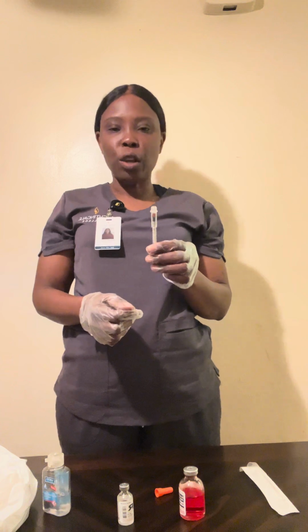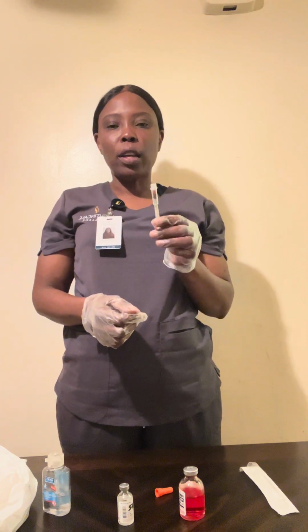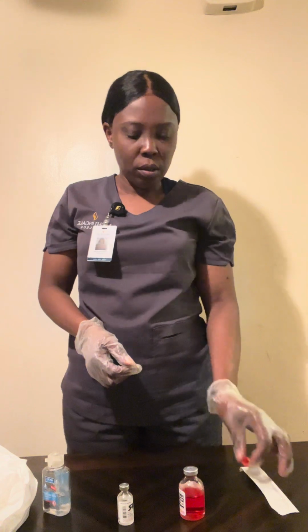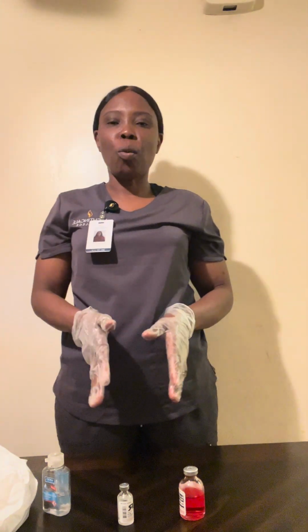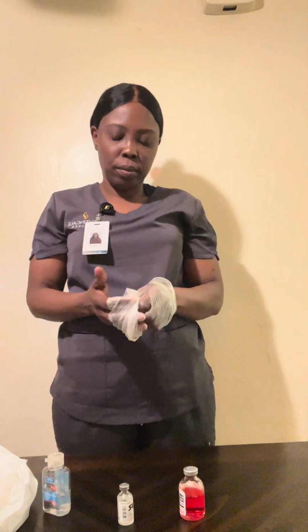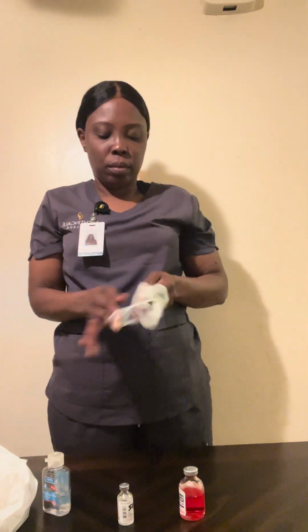After I administer, I'm going to put the syringe in the sharps container, discard everything, and clean up. I'm going to make sure my patient is in a comfortable position, and then remove my gloves, turning them inside out, and put them in the trash.